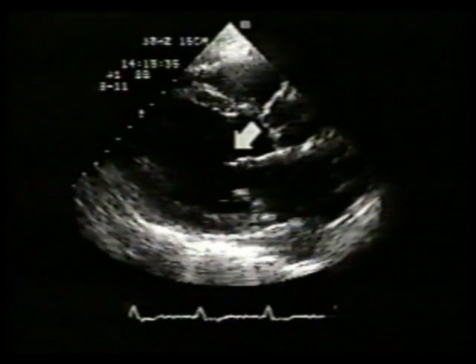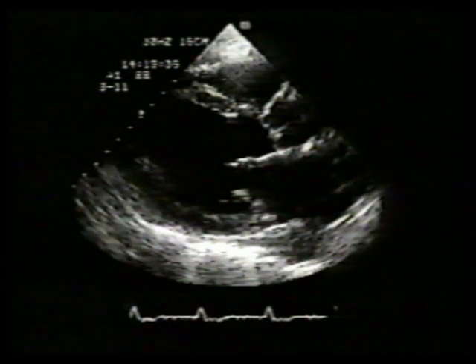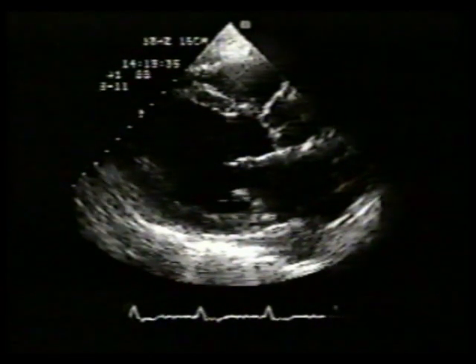As left ventricular systolic function deteriorates, the mitral leaflets are displaced further posteriorly. In real time, you will note that LV systolic function is severely reduced. Her ejection fraction was 27%.